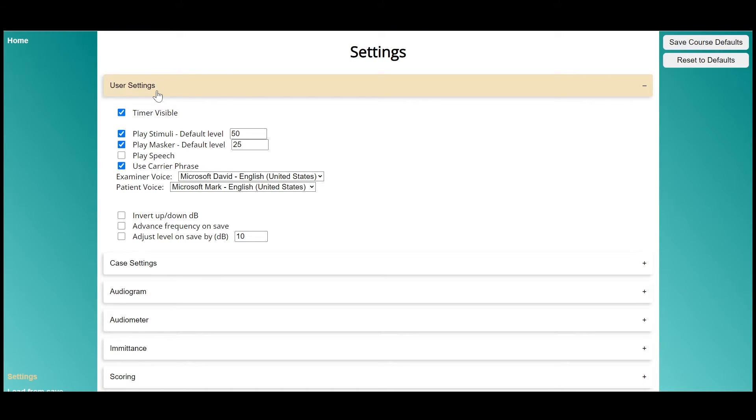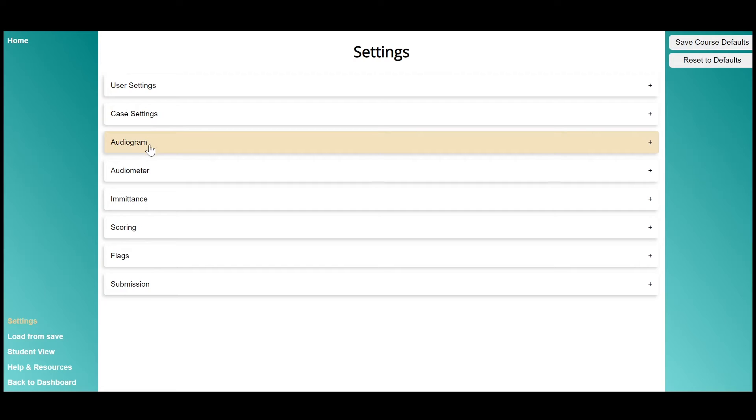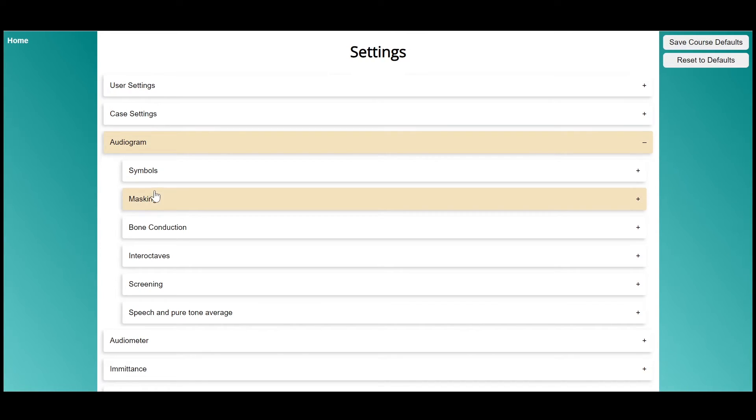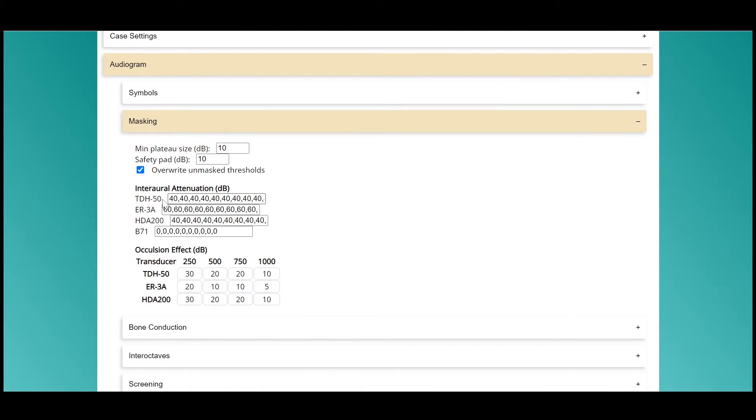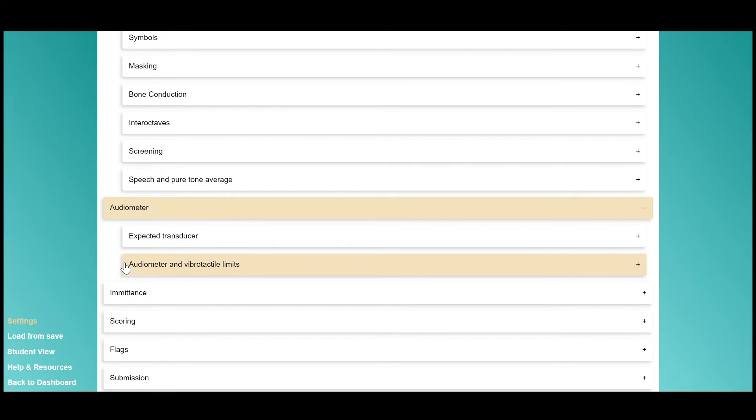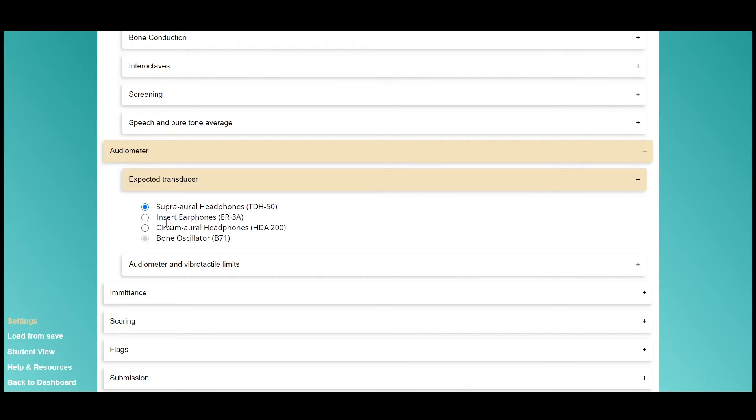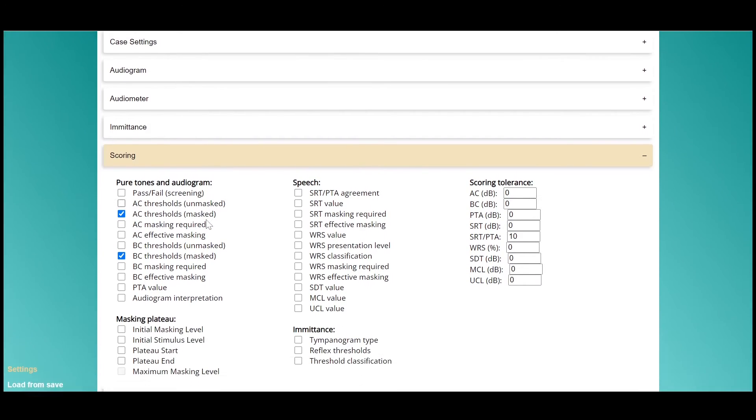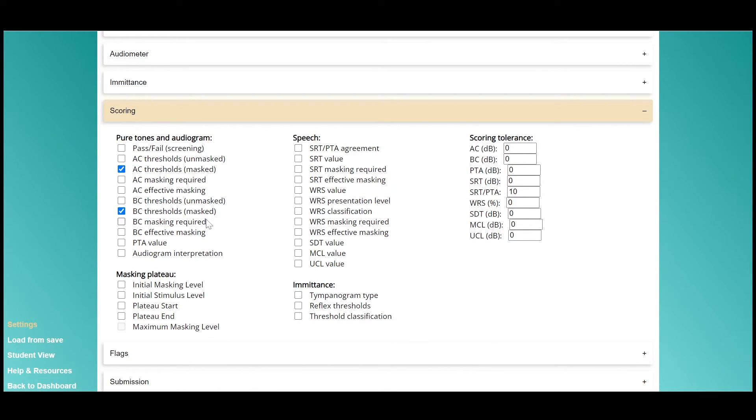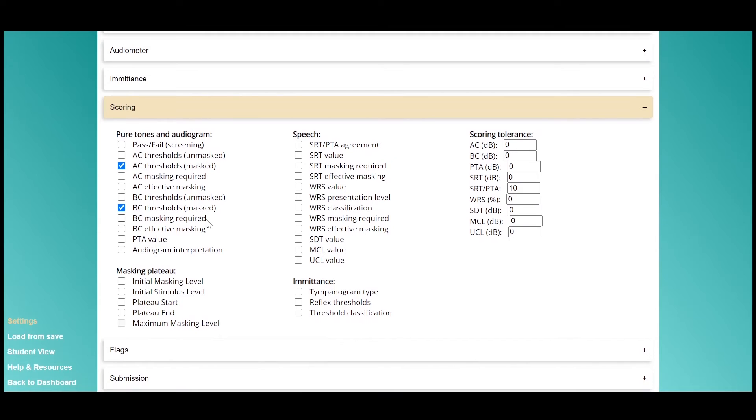One of the best things about Theta is how customizable it is. In the settings tab, you can change settings like the interaural attenuation, the occlusion effect, transducer type, what to score, and whether or not the simulated patient responses are variable or exact.